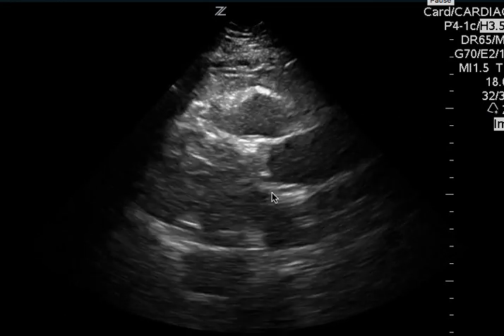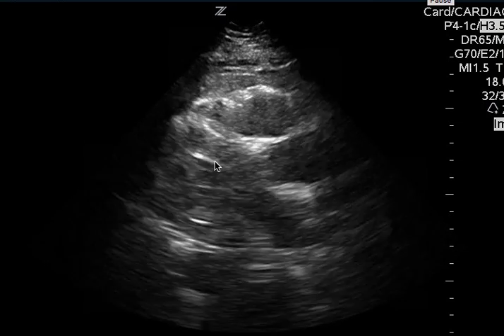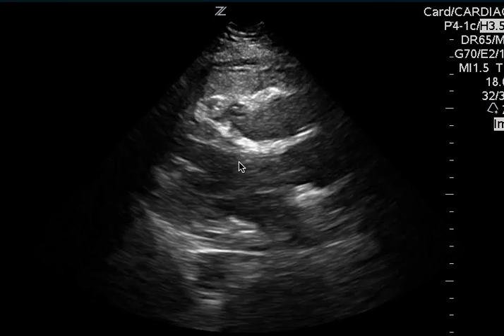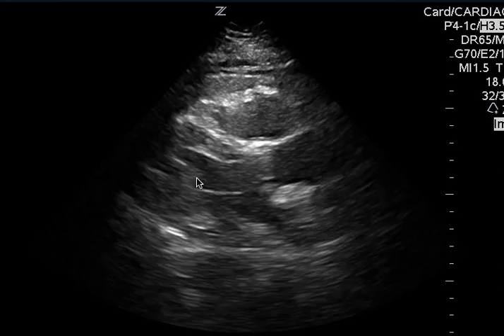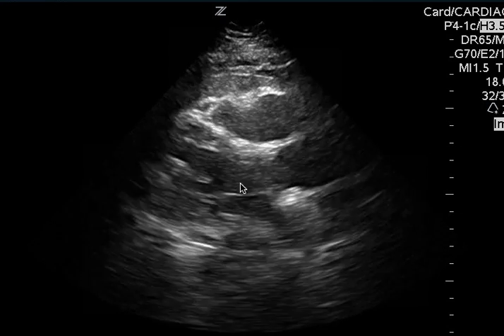This is a different patient, and I took the opposite extreme where this patient is hyperdynamic. If you look at the walls of the septum and the free wall, they pretty much come together, which indicates a good ejection fraction. The valve does hit the septum. Not your classic view, but you can clearly see that the walls are hitting each other, which indicates a good ejection fraction.